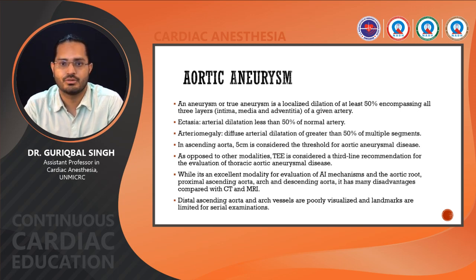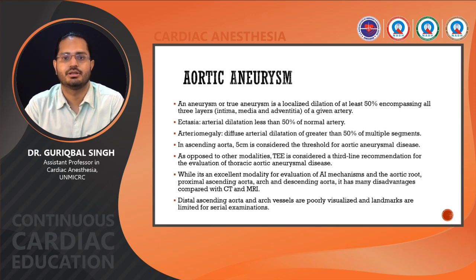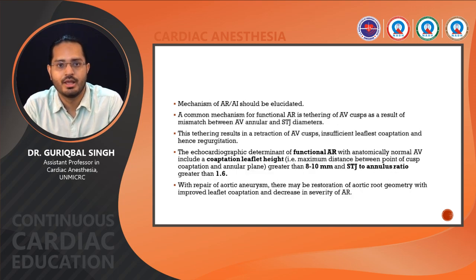While it's an excellent modality for evaluation of aortic insufficiency mechanisms and the aortic root, proximal ascending aorta, arch and descending aorta, it has many disadvantages compared with CT and MRI. Distal ascending aorta and arch vessels are poorly visualized and landmarks are limited. Mechanism of AR should be elucidated.